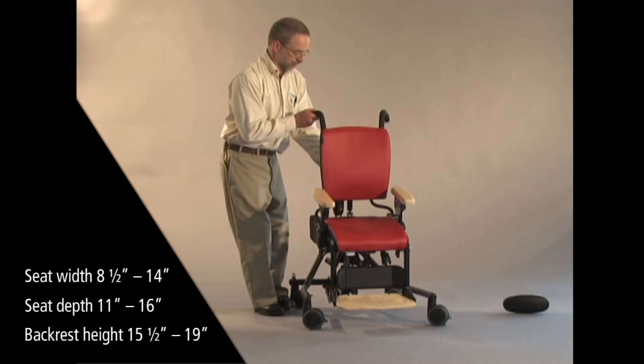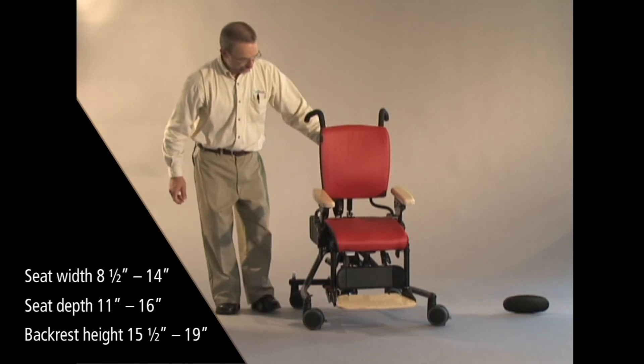Then the backrest all the way up in its highest position looks like this.